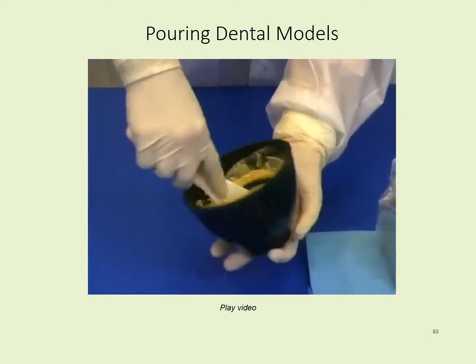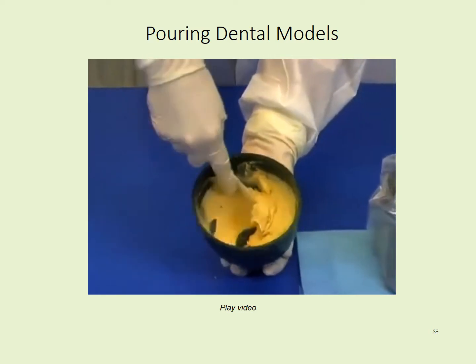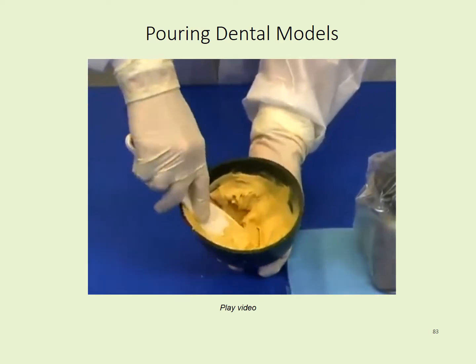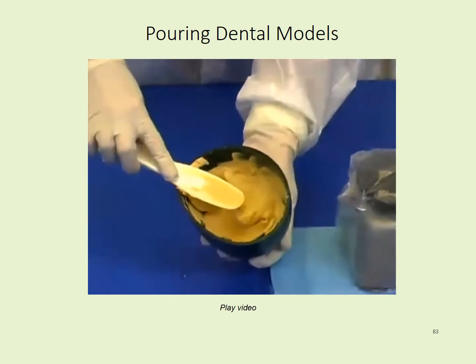Vigorously mix by wiping the spatula against the sides of the bowl to incorporate all the powder and remove excess air. This is called stropping. The mixture should be smooth and homogeneous.